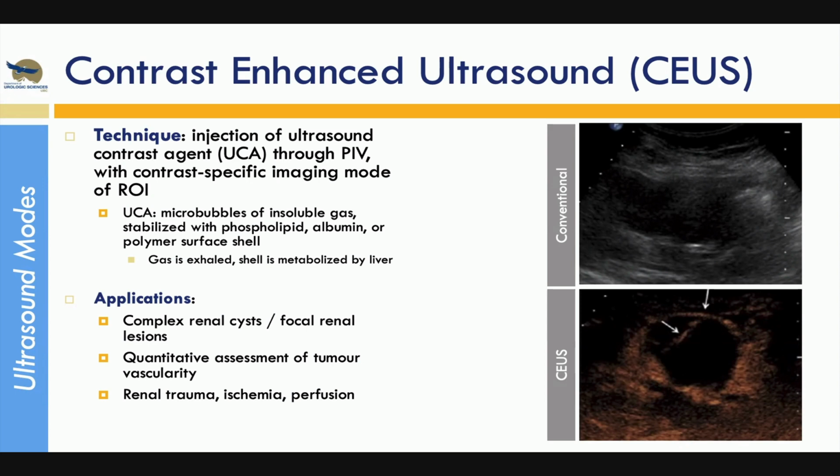The primary uses of contrast enhanced ultrasound are to assess the perfusion of tumors, because you get a washout essentially like you would for a washout CT, which is pretty cool. They'll often use this to image renal cysts or sometimes renal tumors, distinguish pseudotumors from real masses, and you can look at ischemia as well. I'll talk about this later, but sometimes they'll use this to aid in interventional procedures like RFA.